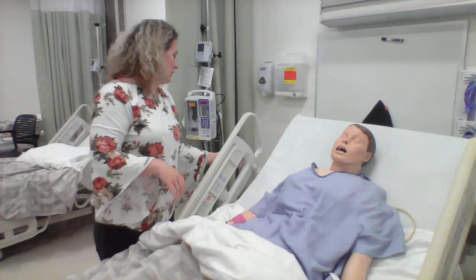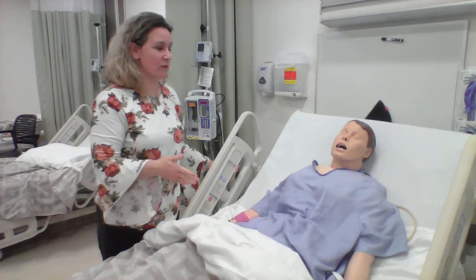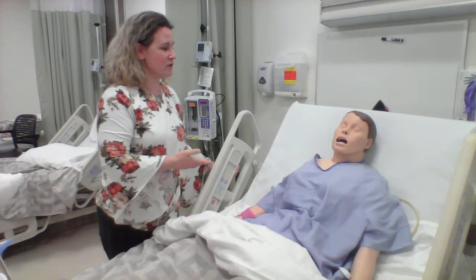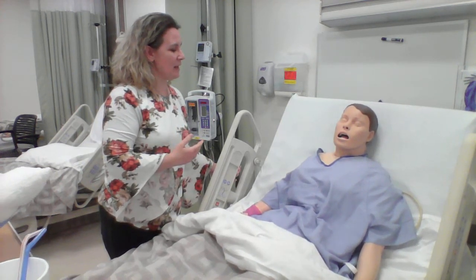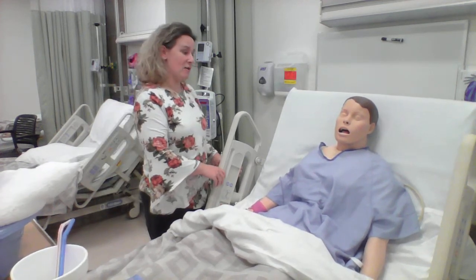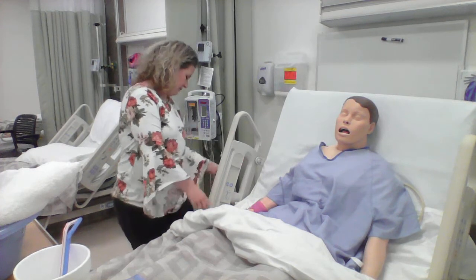So one of the things that I'm going to assess for first is, I'm going to put you in a high Fowler's position. And then I'm going to ask, have you had any facial surgeries, any trauma, broken nose? Are you on any anticoagulants or aspirin at this time? Patient states that they are not, and that they have not had any trauma to the face.